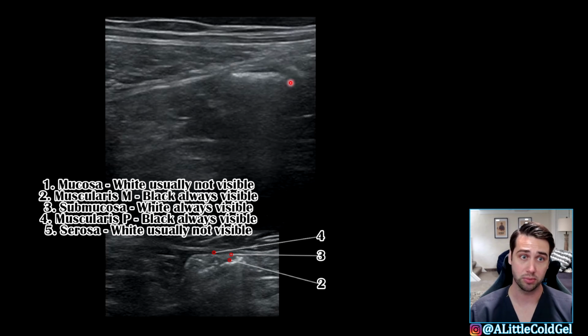But at the end of the clip, you're mostly just seeing one single muscularis layer. You do see a little tiny black line under that mucosal layer, but a lot of times you just see this white with bowel content. Just remember that usually the bowel wall starts with that black muscularis layer first, so include that in any measurements when you're looking for pathology of bowel wall thickening.